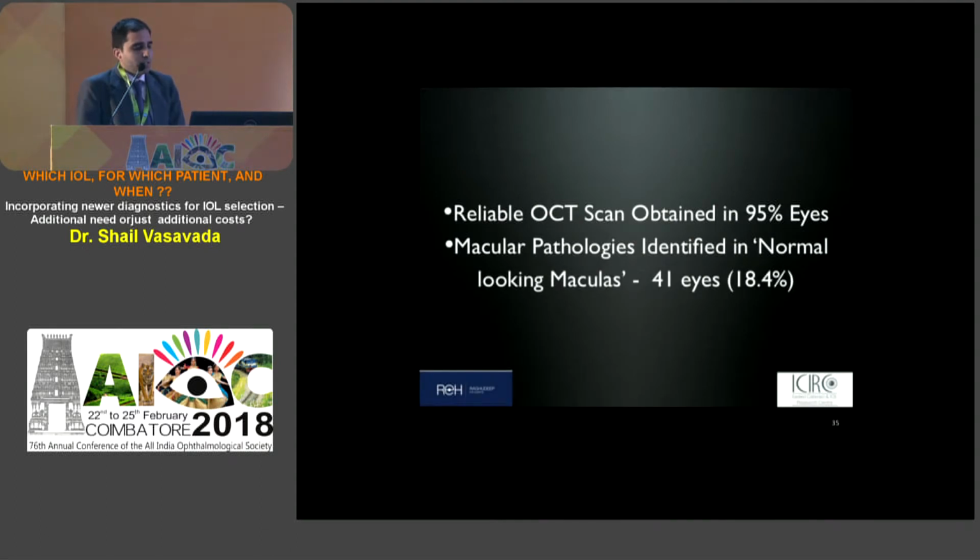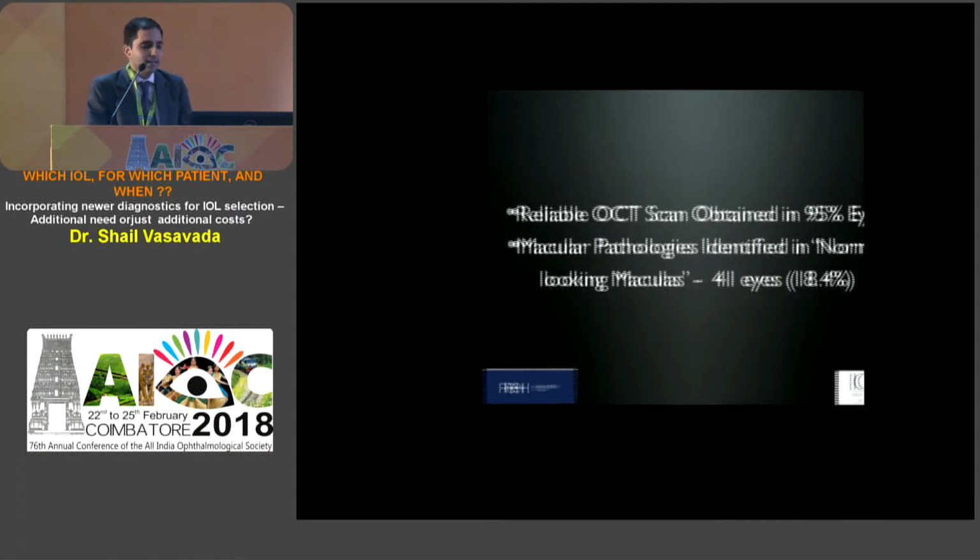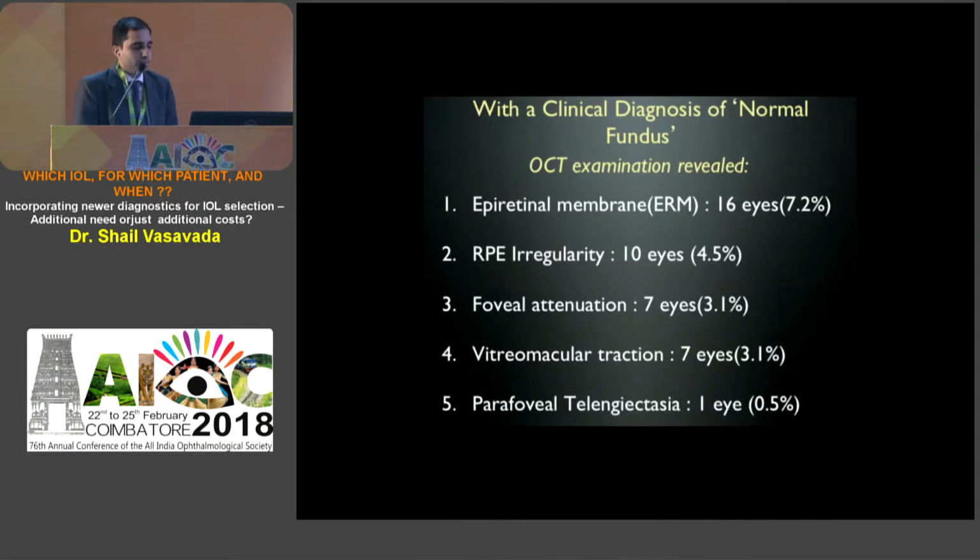What we found in our results, the good part, is that in 95% of the eyes, we could capture an OCT. So the OCT is able to capture even in very significantly dense cataracts. So it has a good penetration.